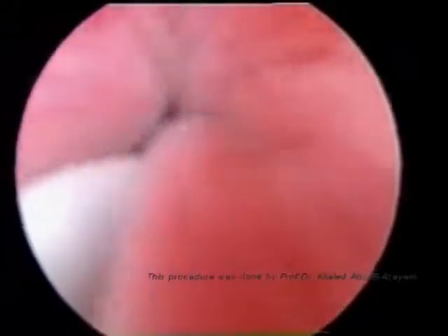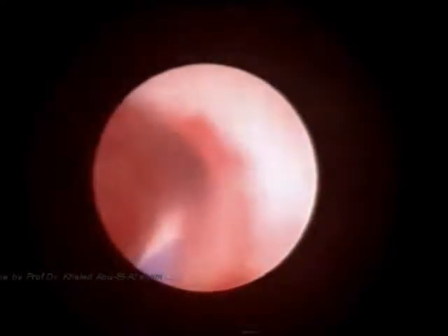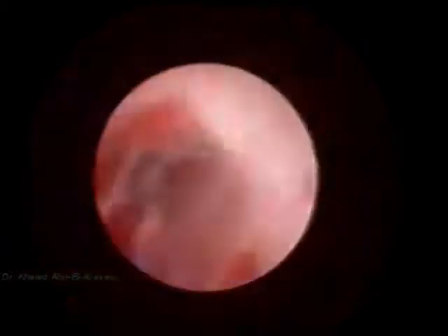This is the bladder neck, this is the bladder and the ureteric orifice, and the guide wire is inserted. Now we are dilating the ureteral orifice, and now the ureteroscope is inserted and going up through the ureter to the upper ureter guided by the guide wire.